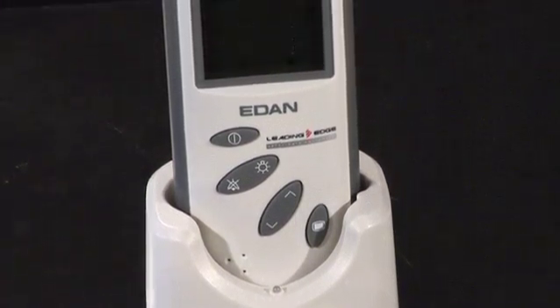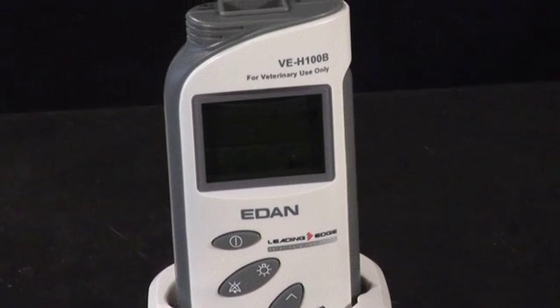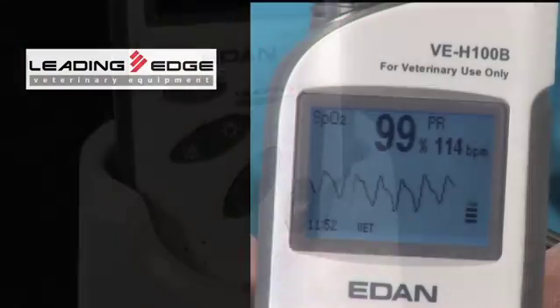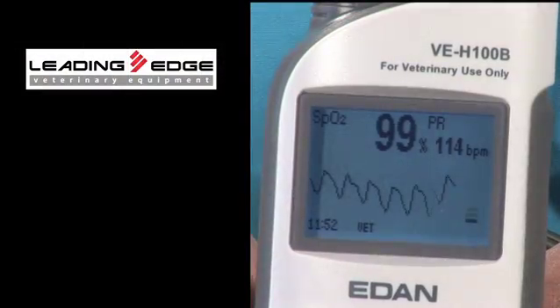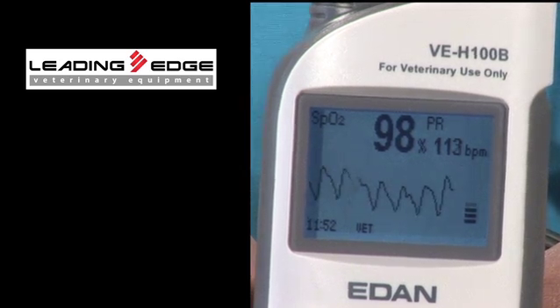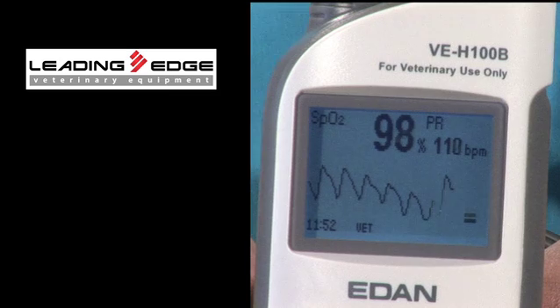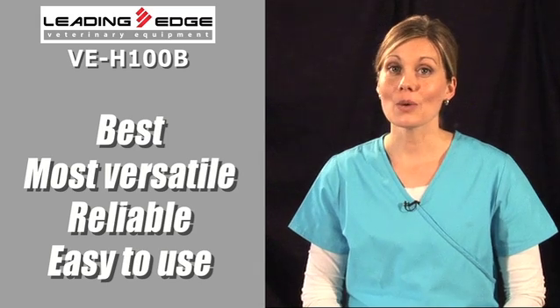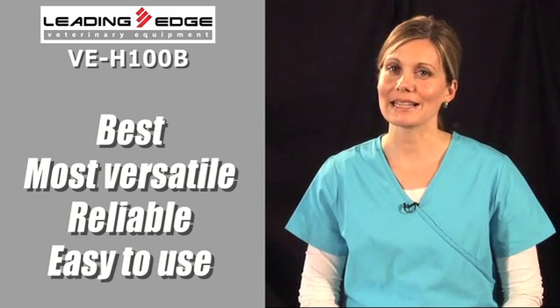If you want a pulse oximeter that has the ultimate sophistication packed inside, you owe it to yourself and your practice to fully experience it. When a single, efficient, compact machine does so much with its dead-on accurate plethysmographic waveforms and multiple parameters, all at an unmatched value, the competition simply doesn't come close. Raise your level of expertise with one strategic move — grab the VEH-100B and let us know if it isn't one of the best, most versatile, reliable units you've ever gotten your hands on, while being exceptionally easy to use.